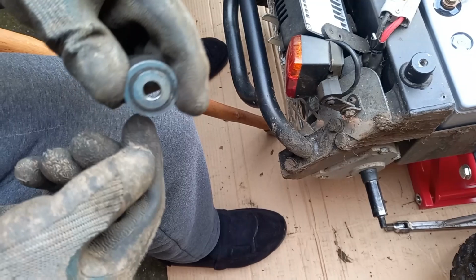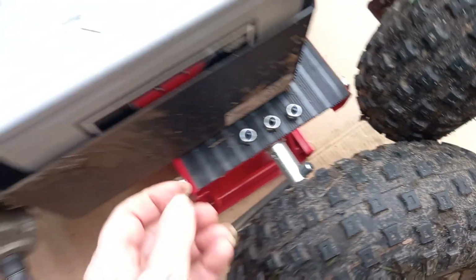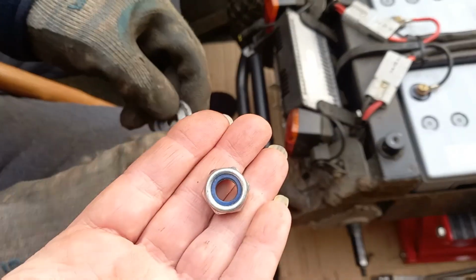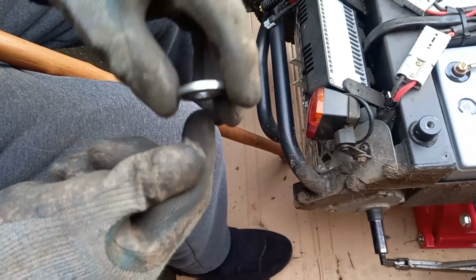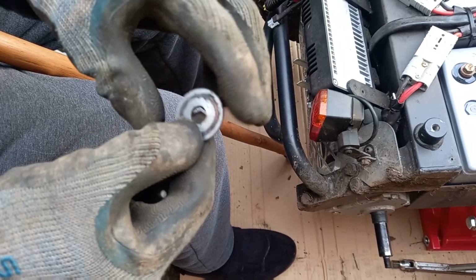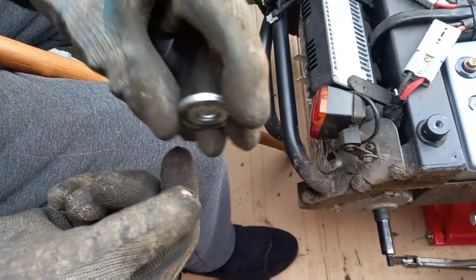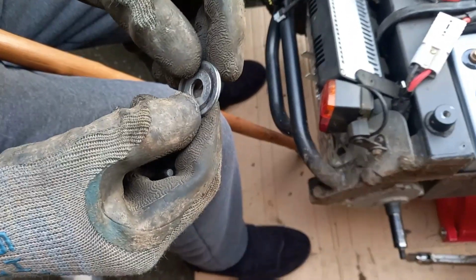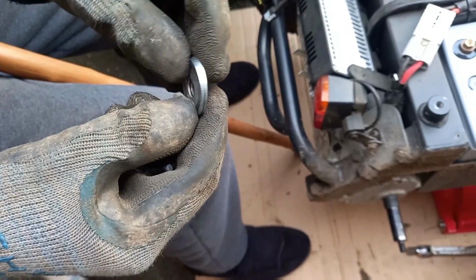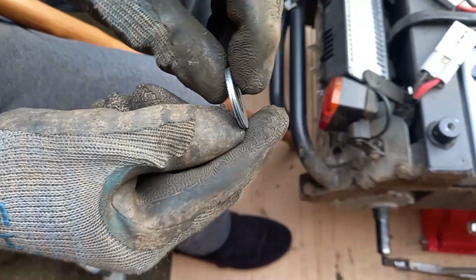Also it has got nylocks on, and I'm going to replace the nylocks. I've found some new nylocks there that haven't been used, because the other ones aren't gripping very well now. So I'll turn these washers round. I haven't got any that are thicker that are exactly the right size, because it's got to be the right OD and the right ID, you see. So these are going to have to do, but I'll turn them back round and let them sort of straighten themselves up a bit when you tighten it, and obviously keep an eye on this situation, because this will always go wrong, because these washers aren't really suitable for the job, to be honest.